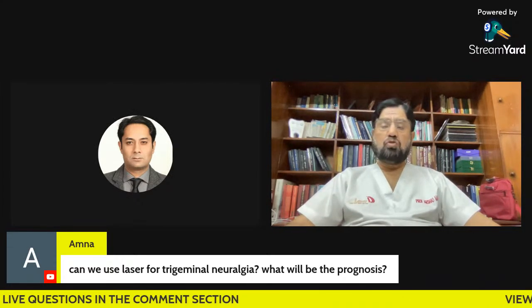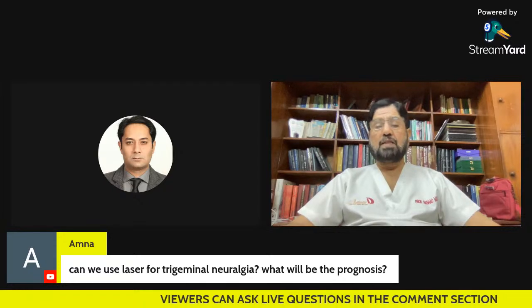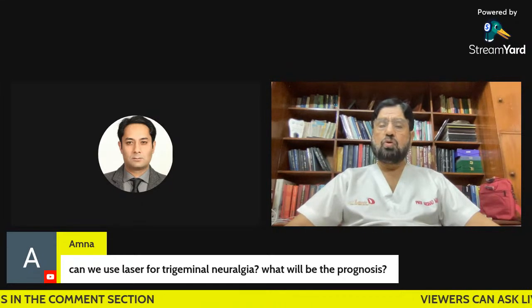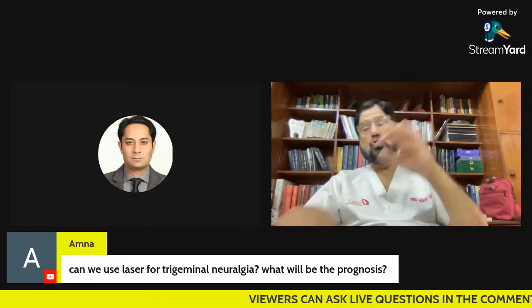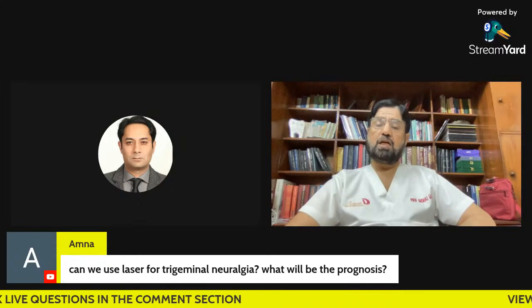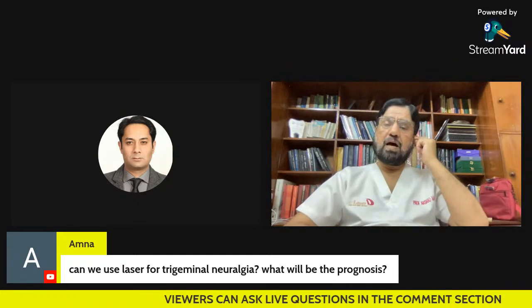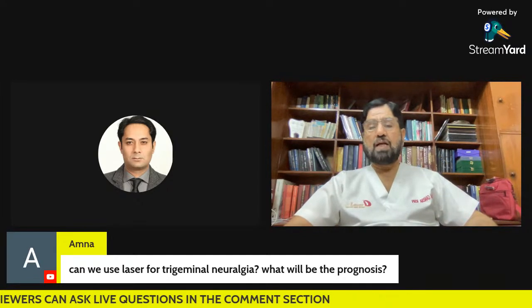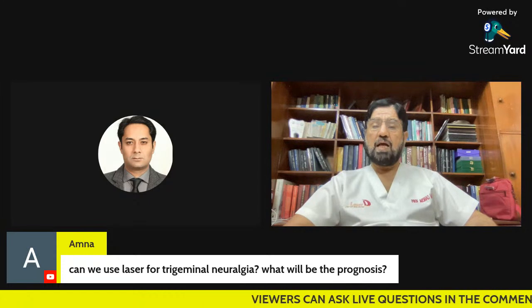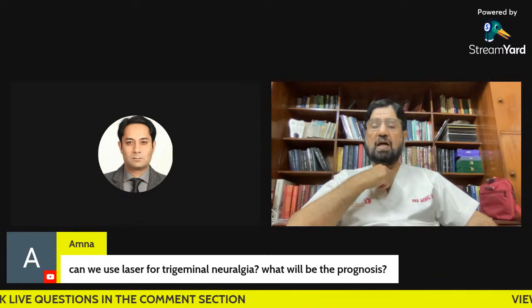In trigeminal neuralgia, we can use the laser in two ways. One is the neurectomy. You open it and go for the neurectomy by the carbon dioxide laser or the Nd:YAG laser or any hard laser, with which you ablate the nerve tissue. It has been shown that when we apply neurectomy by laser, there is less neuroma formation post-operatively. There is good coagulation of the nerve trunk posterior to the foramina in the canal, whether it is the inferior alveolar canal or the infraorbital canal. You send the probe right into the infraorbital canal, and the ablation of the nerve is right posterior to that. There is less bleeding, less post-operative neuroma formation, and we have seen less regeneration of the nerve ending.